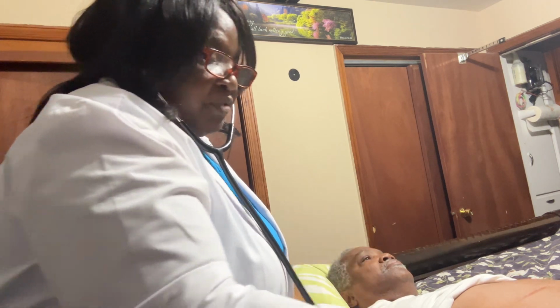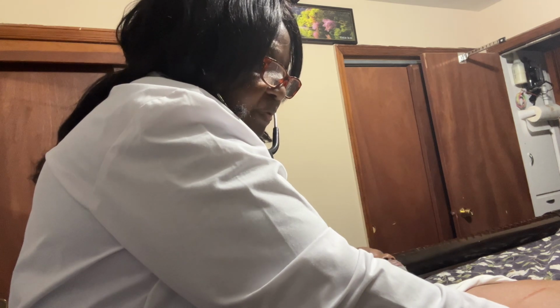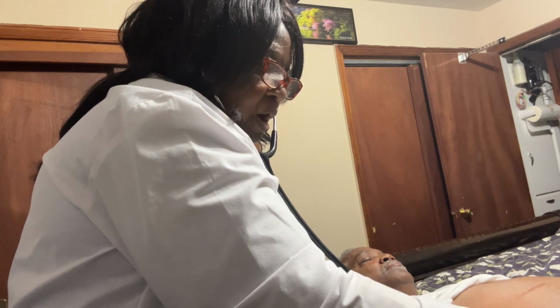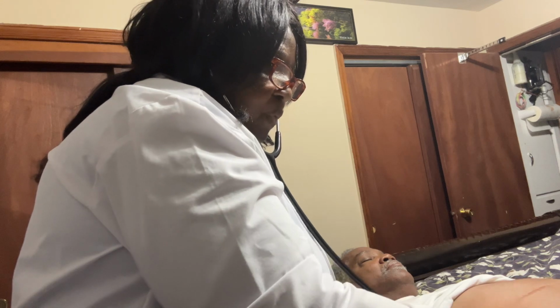There are no bruits. And then for modesty, I'm not going to pull down the blanket any farther to auscultate the femorals. I'm just going to place the stethoscope on top of the covers and verbalize that there are normal pulsations. There is no bruits with the diaphragm and with the bell.